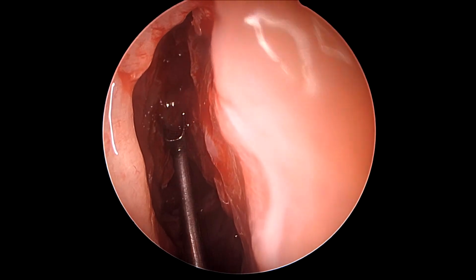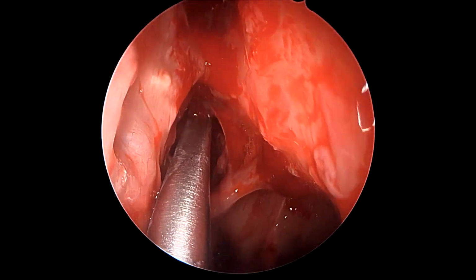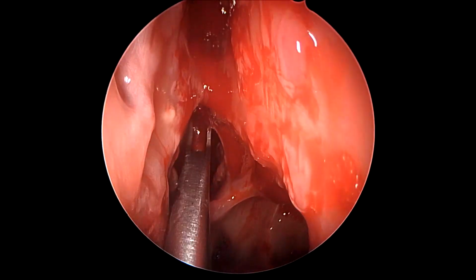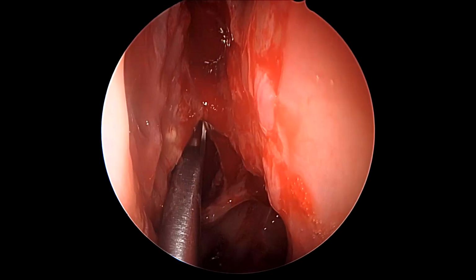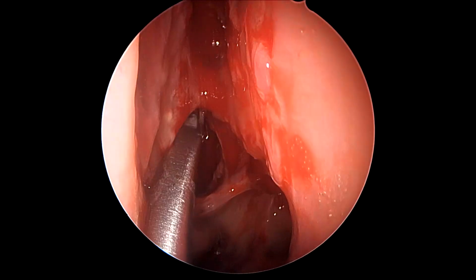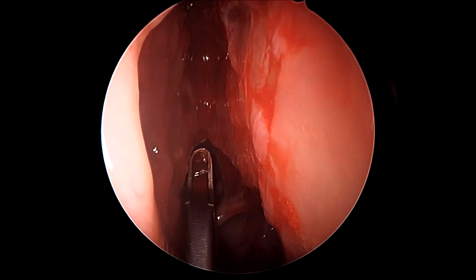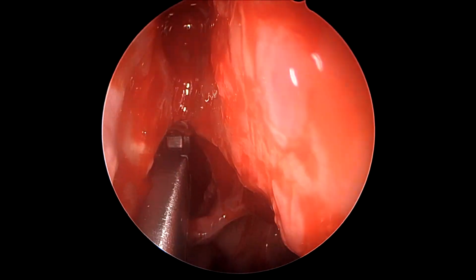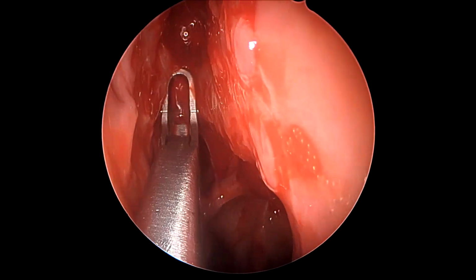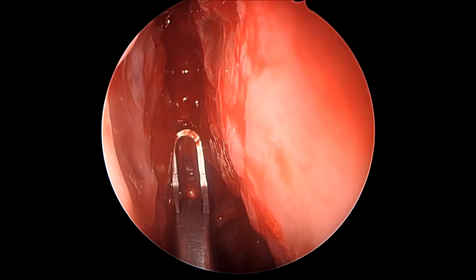Now, with the frontal sinus curette, we can gently palpate more cells as we remove them. And now, since some ethmoidal septations were remaining, as we had seen in the preoperative CT scans, it is prudent to remove all those septations as much as possible flush to the roof of the nasal cavity and the roof of the ethmoids, to be able to achieve clear access and remove the amount of redundant mucosa and bone that could lead to recurrence of polyps.